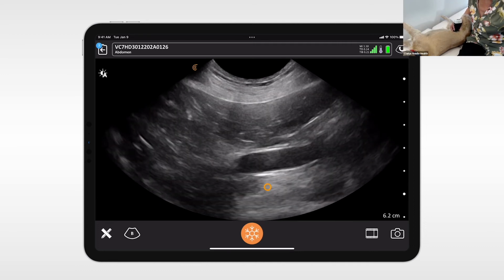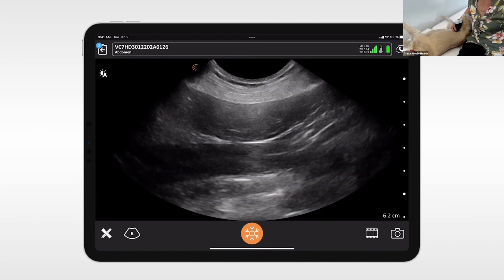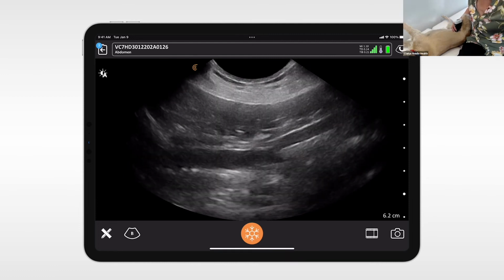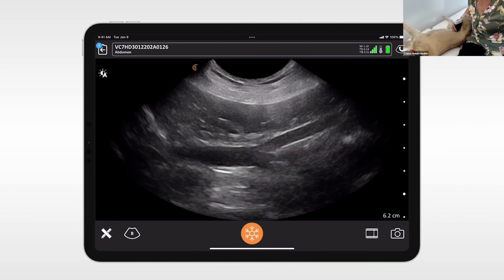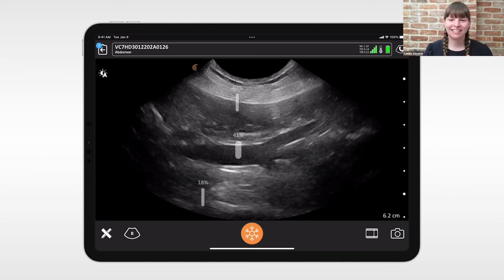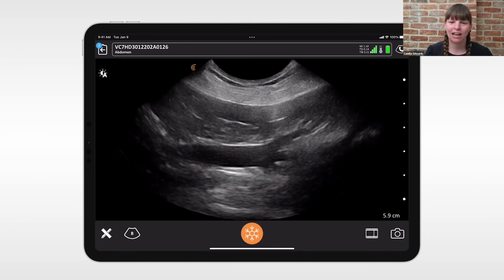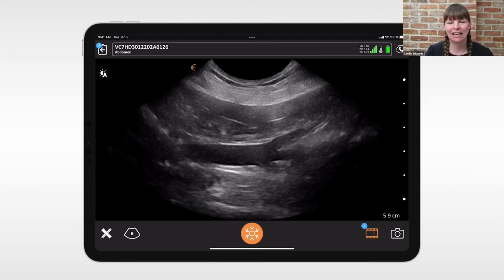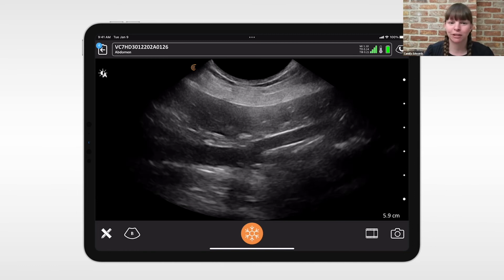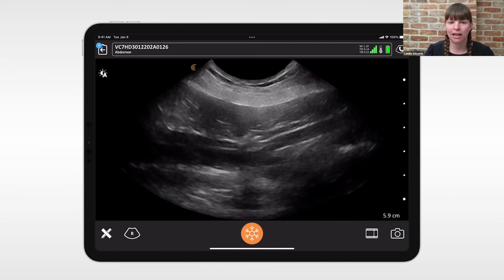So try and follow the aorta. That's lovely. Actually, the trifurcation looks more like a trifurcation from where I am here. Yeah. So this angle, it's great. You've got both external iliac arteries coming off there, so you can really clearly see the trifurcation. And then we're similarly looking for a hypoechoic structure lying up against the external iliac artery.